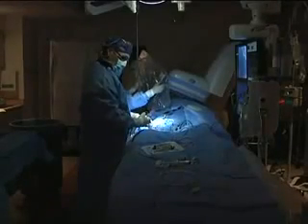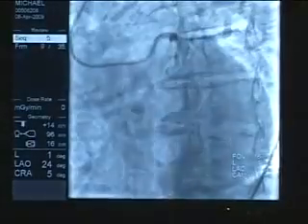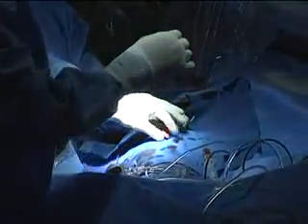Right now we're placing a guide catheter into the right coronary artery, which is occluded. On the bottom screen we're going to show the vessel as it is now as a road map, and then we're going to restore that vessel to normal. The first thing we need to do is place a wire and manipulate it across the blockage in order to place all of our equipment. We've now gotten the wire across the blockage. We're going to place the export catheter beyond the blockage if possible.